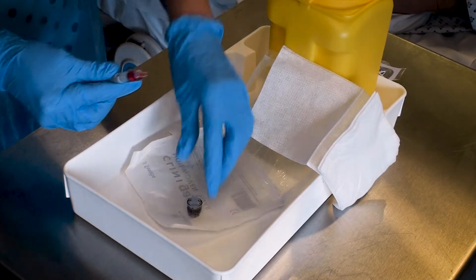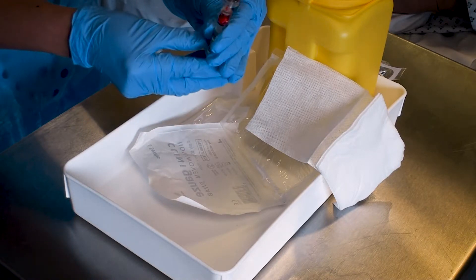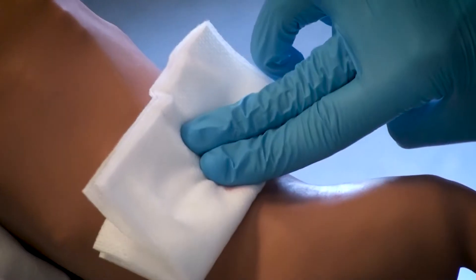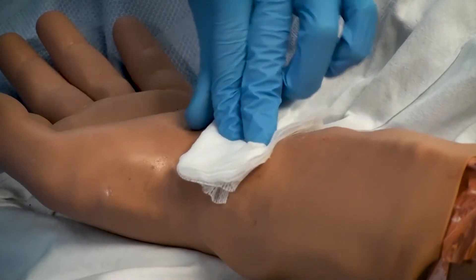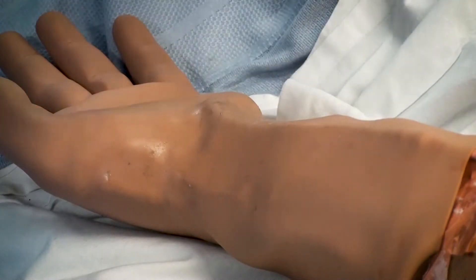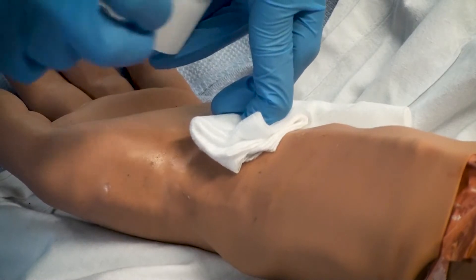Dispose of the sharp appropriately and put the cap back onto the ABG syringe, ensuring it is filled to the line ready for sampling. Pressure must be exerted on the puncture site for at least five minutes after the sample. If the patient is able, ask them to provide this pressure; if not, either yourself or another healthcare professional will need to apply the pressure whilst somebody else takes the sample for processing.